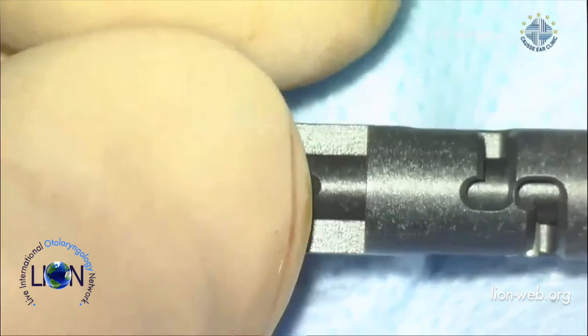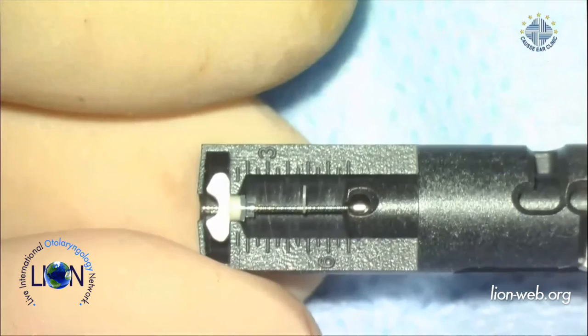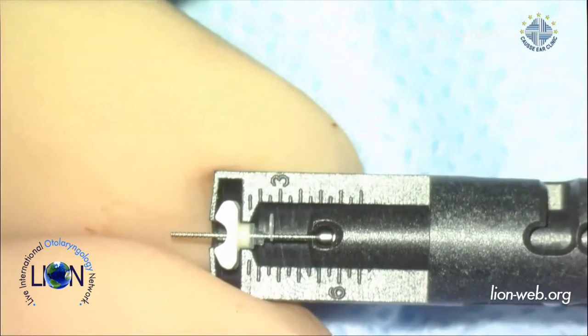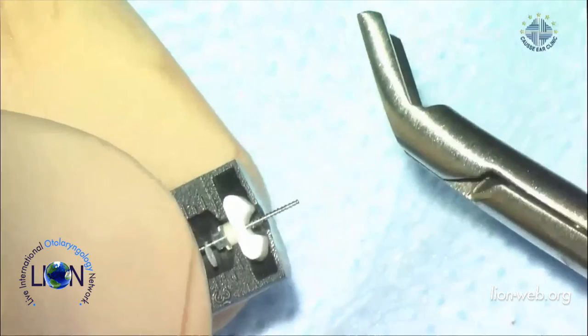So I want to cut it at 6.5. So I have to take into account the fact that the shaft is pushed through the prosthesis head, which means 1 millimeter. So I need to place the shaft at 5.5. And then when I will pull back the shaft, it will go back to the 6.5 length. So you can see now, the distal tip of the shaft is at 5.5, which is fine. So I will now cut the titanium distal tip here. All right, and then I will pull the prosthesis back and we get the 6.5 length TORP.